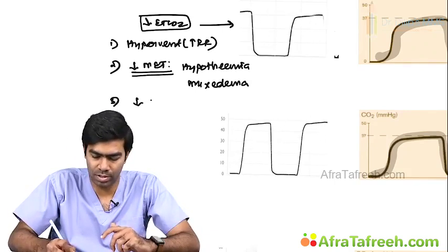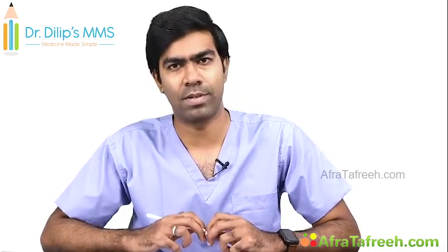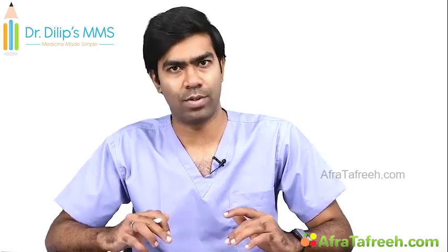Number three, reduced circulation, or I can write conditions that produce reduced perfusion, like pulmonary embolism, cardiogenic shock, cardiac arrest, or probably even, as we talked about, increased intra-alveolar pressure causing high PEEP and very high levels of positive pressure ventilation. All these things can produce reduced circulation. Because of that, you might get low EtCO2. Clear? So remember, this low circulation producing low EtCO2 will definitely increase the EtCO2 and PaCO2 gradient. That value will also be increased.